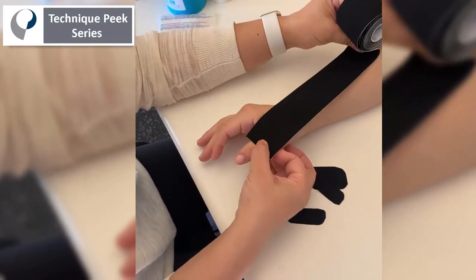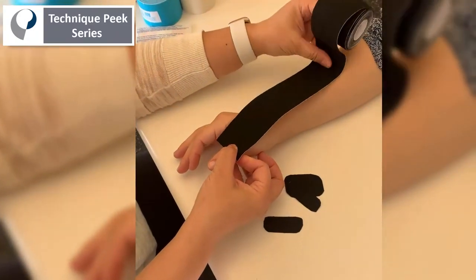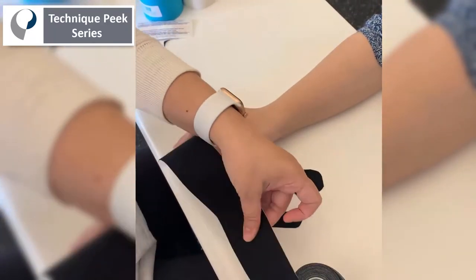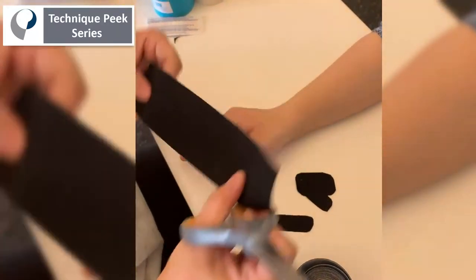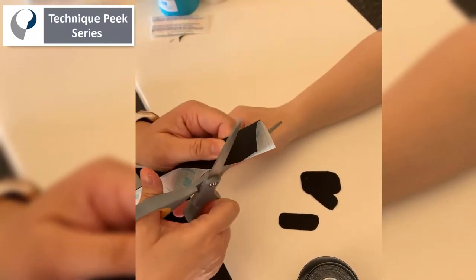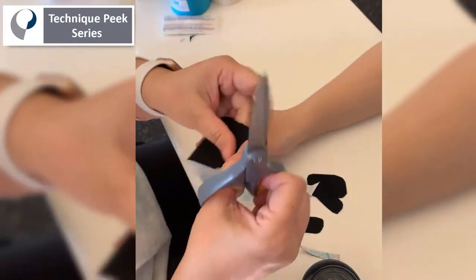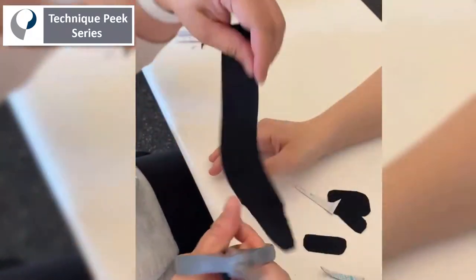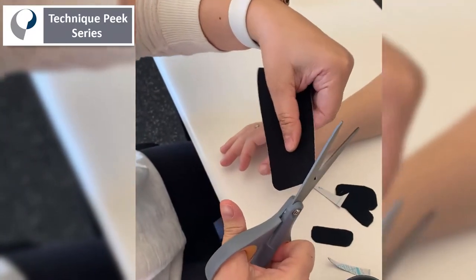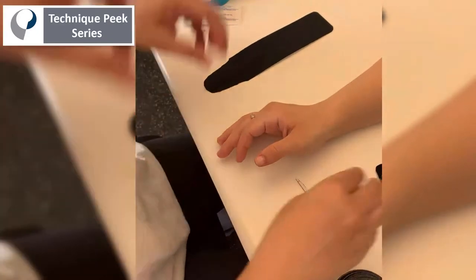I start measuring the tape from just proximal to the IP joint to about two-thirds up the forearm. Then I taper one end because the thumb is a little bit thinner. All the edges have to be round — if they are square, they will get caught and fall off faster.